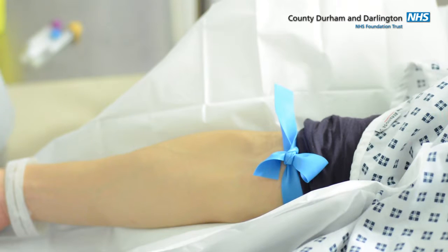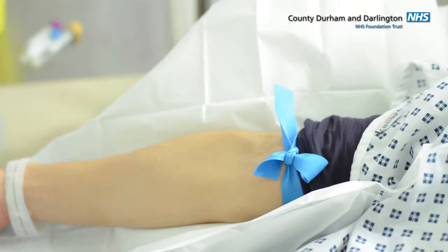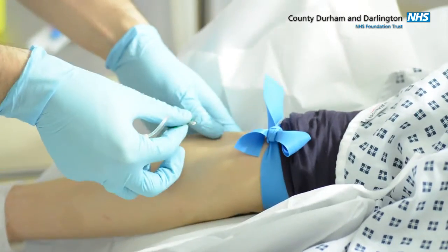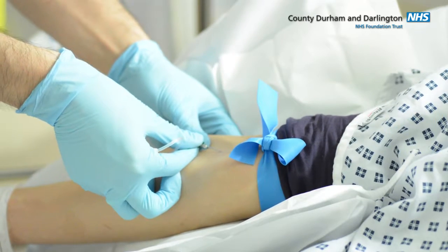Warn the patient of the imminent injection of the needle. You might feel a sharp scratch going in, alright? That's fine. Sharp scratch.